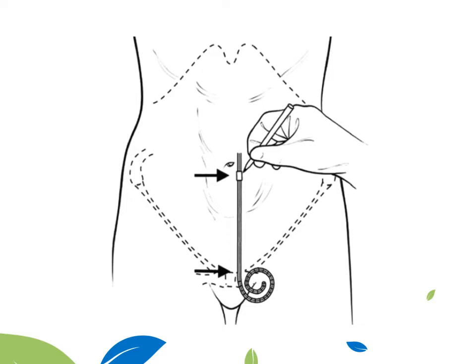Usually, you measure the size of the catheter you want to implant in your patient by measuring the distance between the deep cuff of the catheter, which should be located 2 to 3 centimeters below the umbilicus, and the end of the straight part of the catheter, which should be at the suprapubic area where the catheter is inserted.